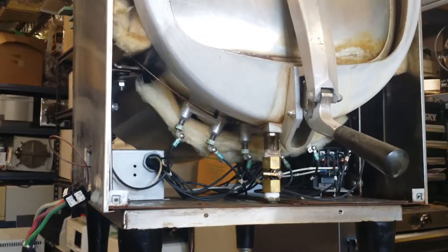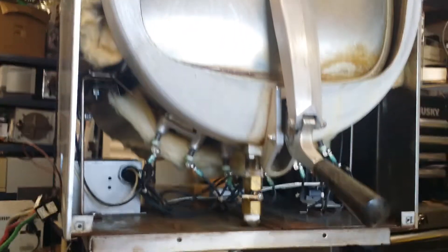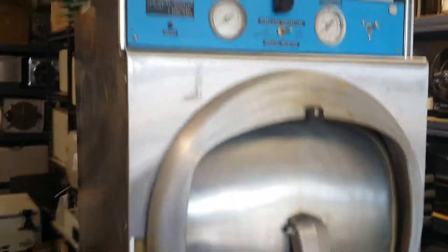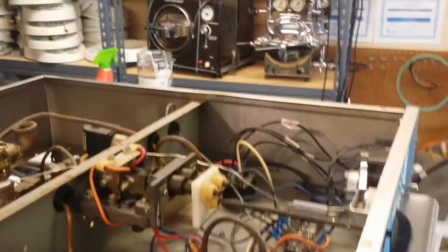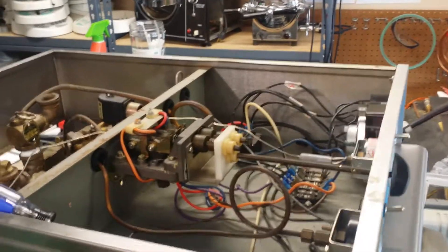Hi, good afternoon. My name is James from iStreet.com. This video will show you how to repair the MarketForge STM-E and STM-E L autoclave. The MarketForge autoclave is one of the best autoclaves for laboratory customers, and on the top you can see the control unit.